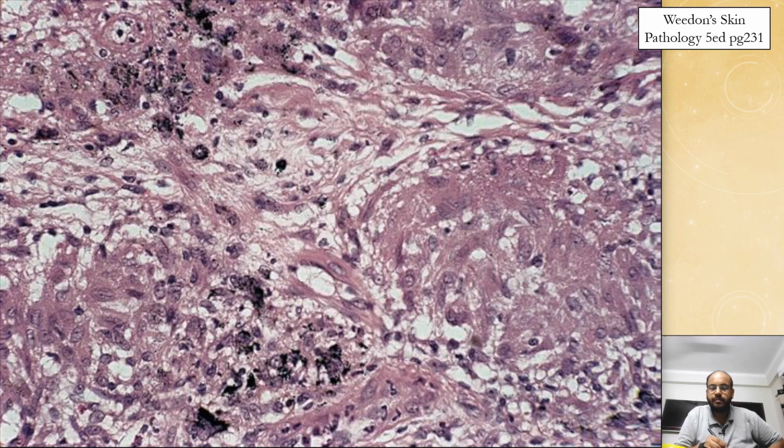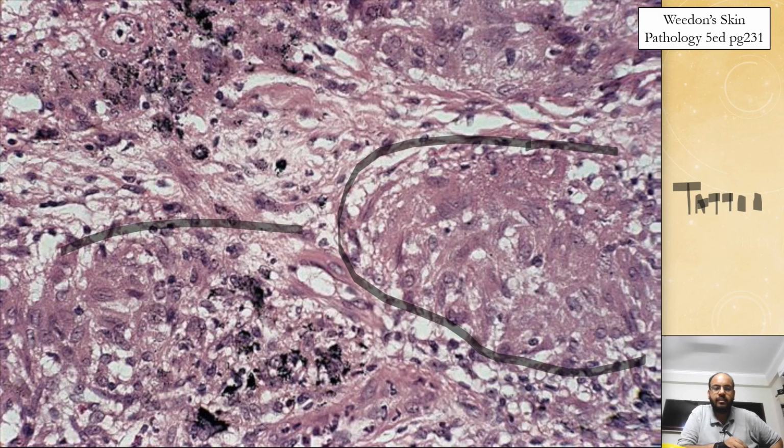So here the material that we can see, this blackish pigment, is actually tattoo. Okay, so tattoo has gone inside, it's gone deeper, and it has led to a tattoo granuloma, which is a type of foreign body granulomatous tissue reaction pattern. And this whole collection here is actually histiocytic collection. And in between the histiocytic collection, you see a foreign material, the tattoo pigment, the color.